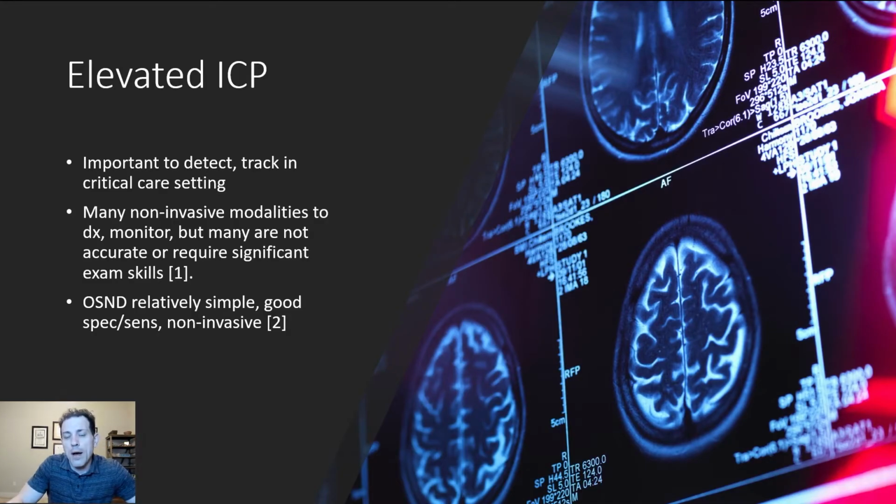So, why are we interested in ICP management? Well, of course, we need to know what the ICP is, especially in some of these traumatic and non-traumatic brain injured patients, whether or not we need to institute treatment or not. Now, there are many non-invasive modalities to diagnose this, but many are not accurate or require significant exam skills.